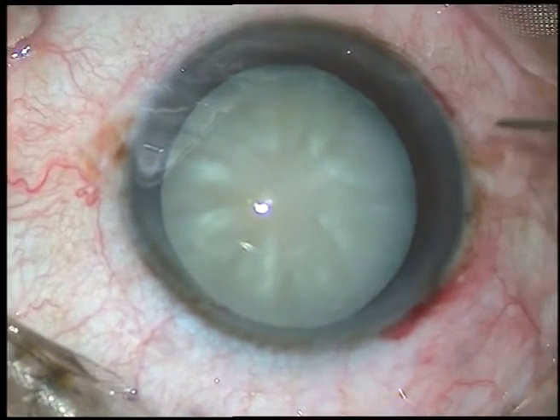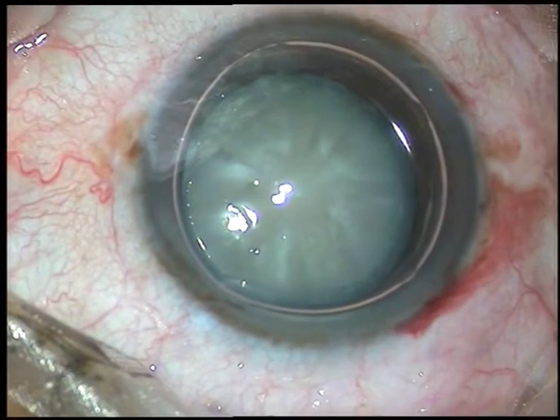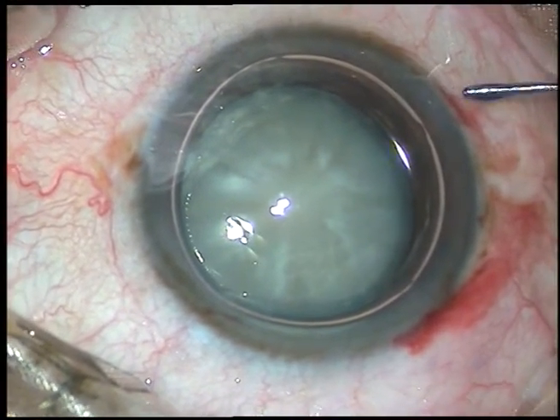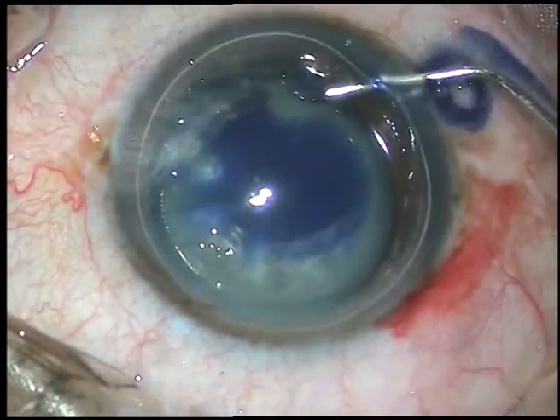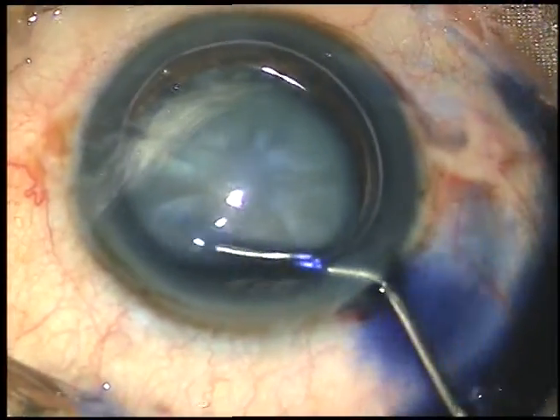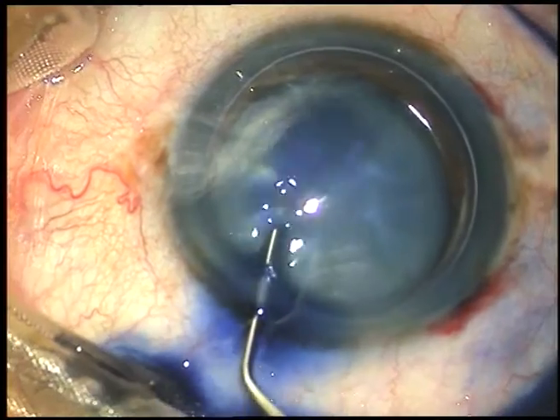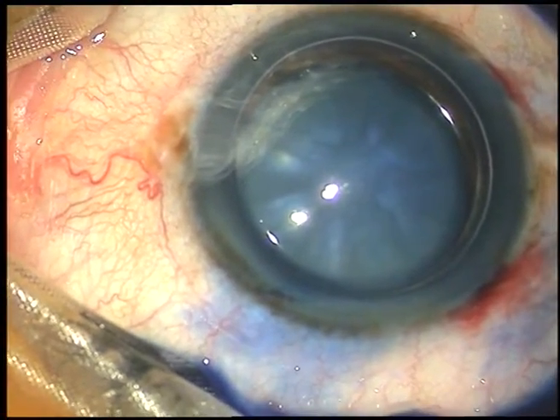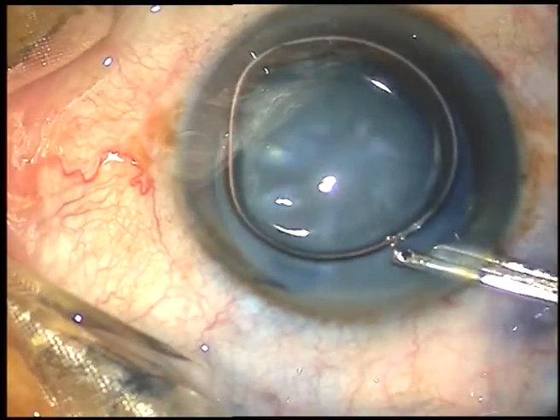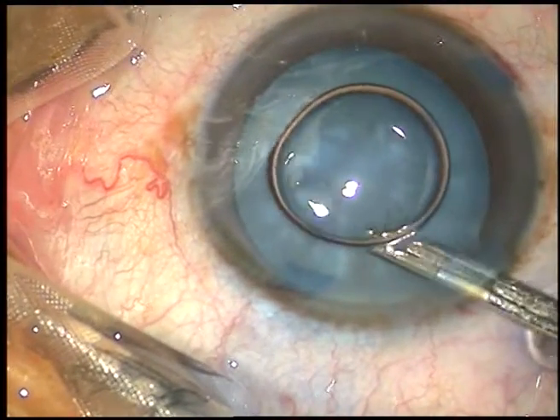Now, I am going to stain the anterior capsule under this air bubble. Trypan Blue 0.06% dye is injected and it is sprayed on all parts of the anterior capsule. Now, I wash the dye out using BSS, balanced salt solution.